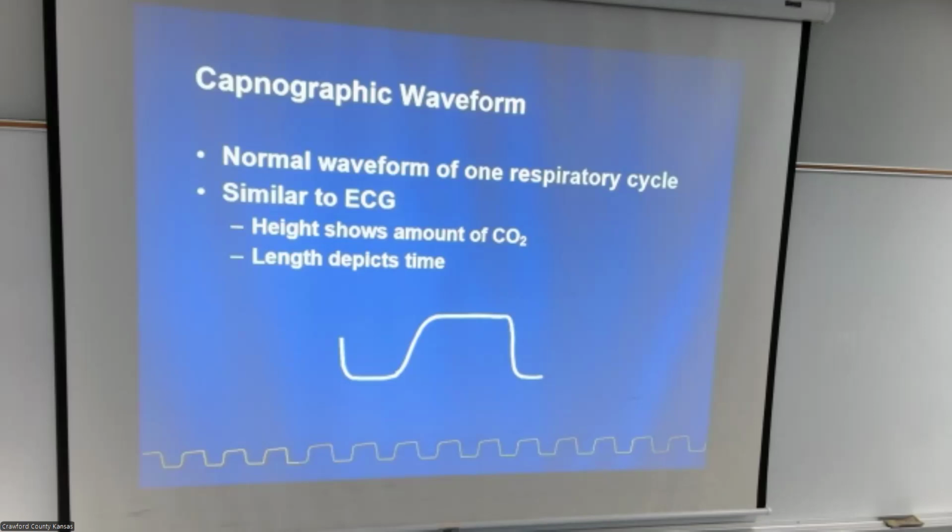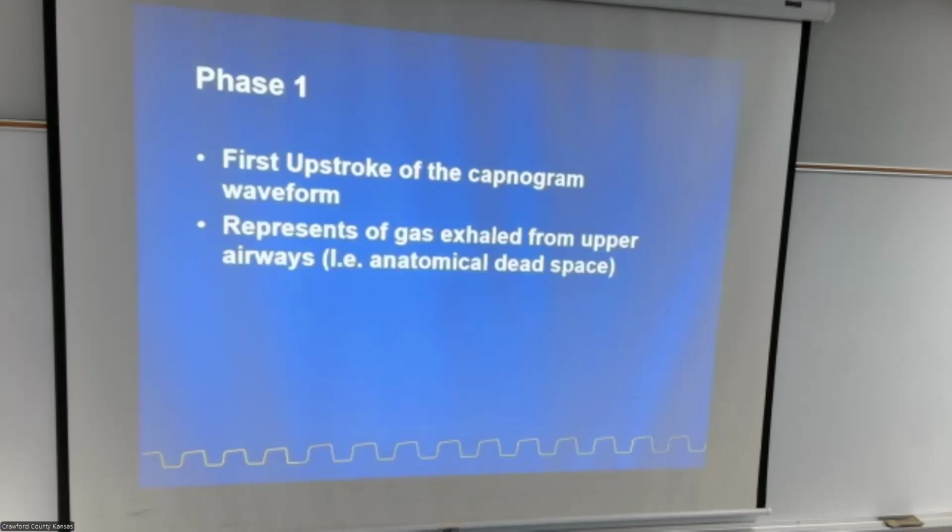A nice ventilated patient. It's not rounded. It's nice and flat. This is perfect for everybody. This is exactly what we want every patient to look like. It's not what happens in life.